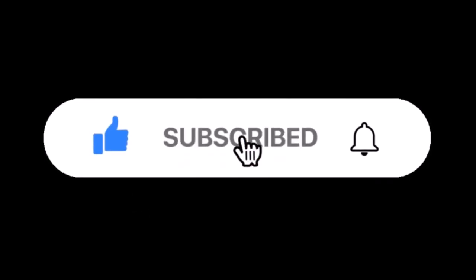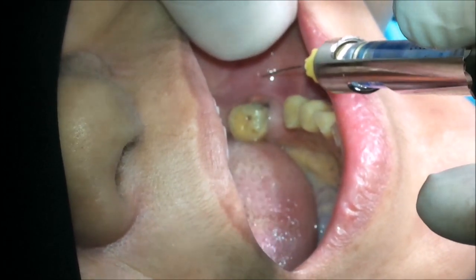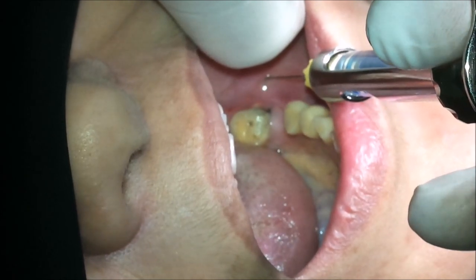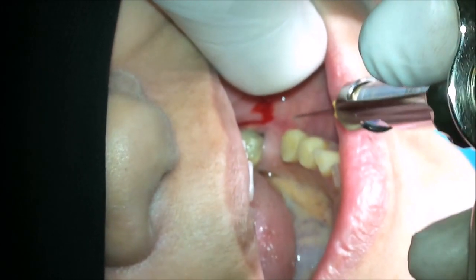In such a condition, I always prefer to make the incision and the reflection of the flap before starting the extraction to avoid any tissue laceration. You can use the inferior nerve block anesthesia or the infiltration anesthesia.